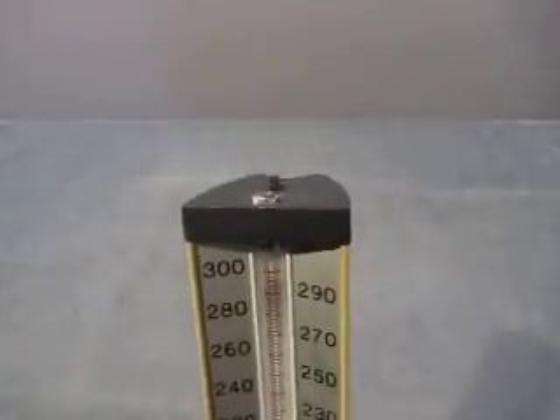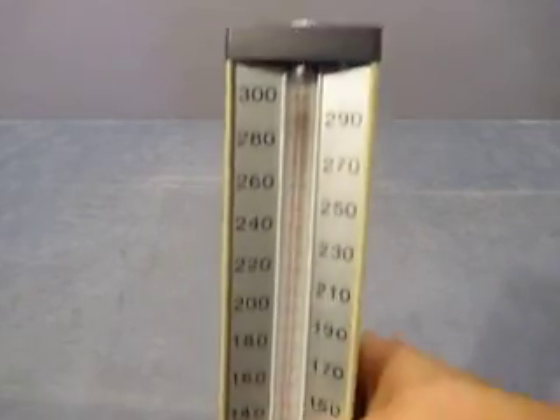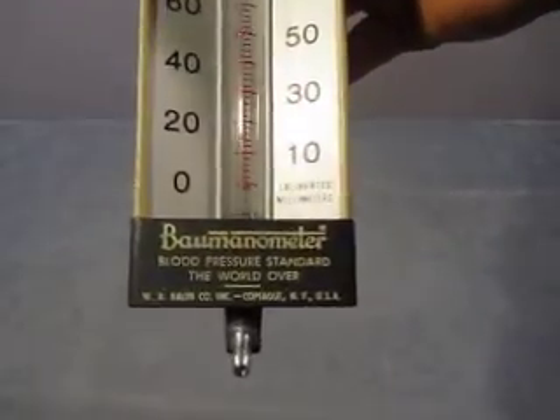Let's bring it up here. Blood pressure 300 — not a good thing. So there you go. Manometer.